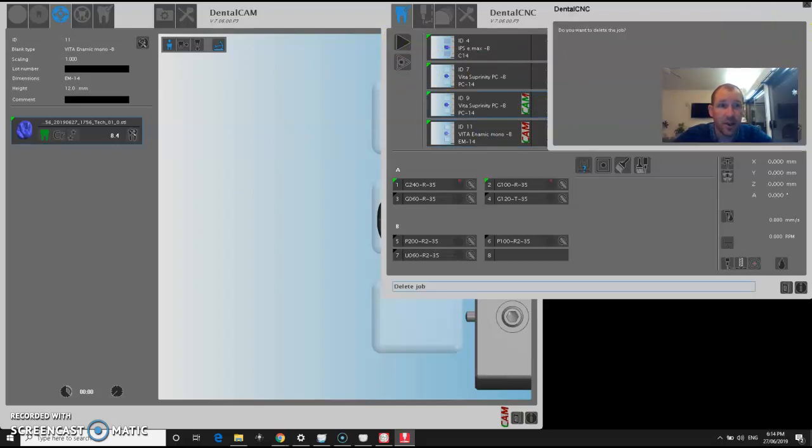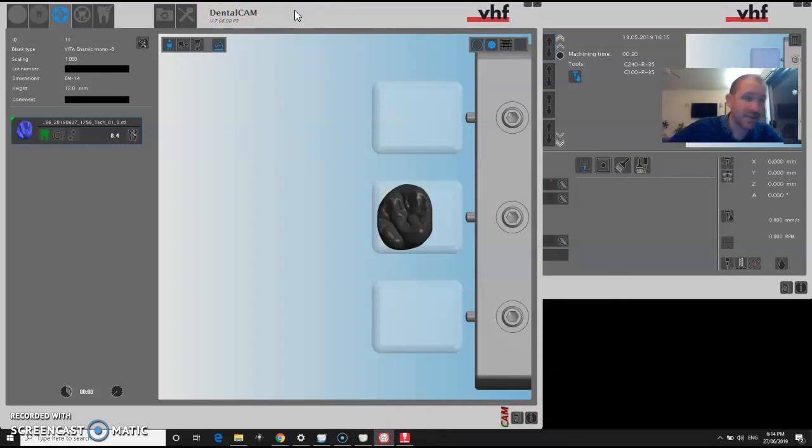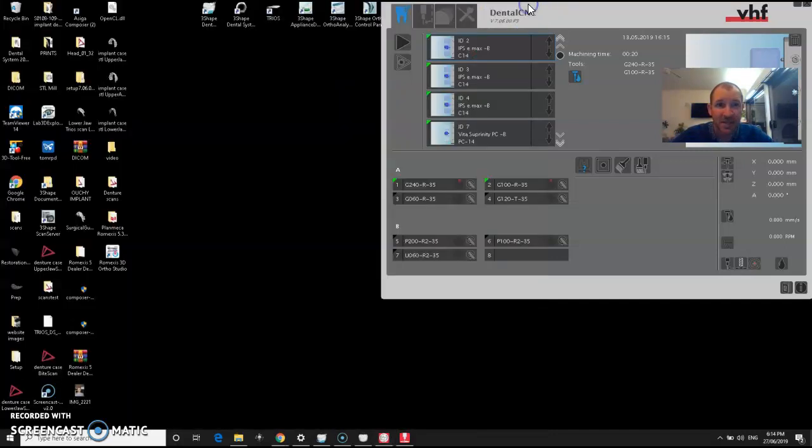I hope this video makes sense, and I hope it allows you to make a good decision. That's most probably within a 10-minute window the best way that I can explain both software. As I mentioned, going through both, you can see why I'd most probably be more inclined to say the Trios design software is a little bit better. It's more ideal for someone that doesn't want to spend as much time doing jobs. So, all good. Thanks. Catch you then.